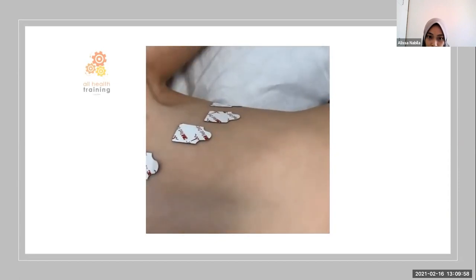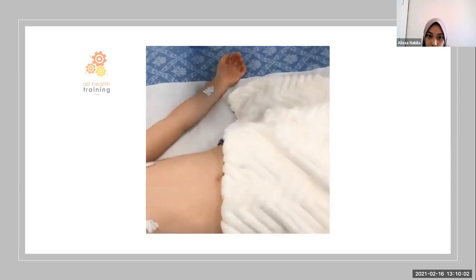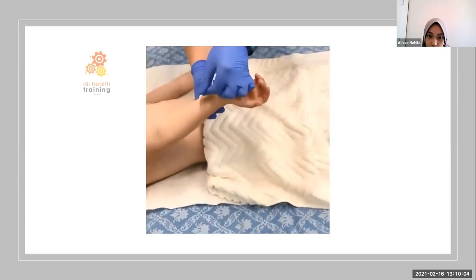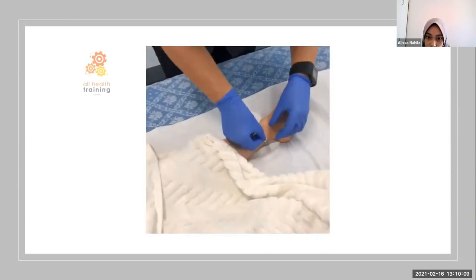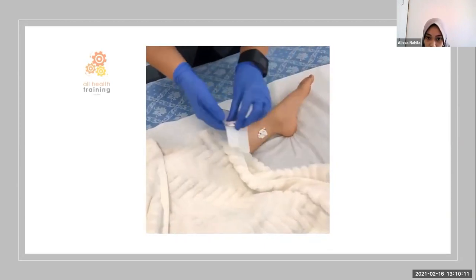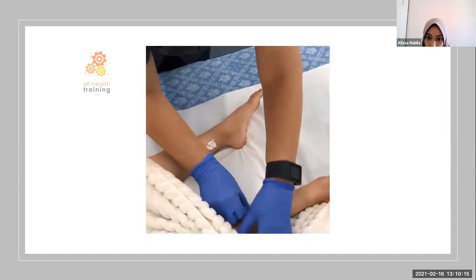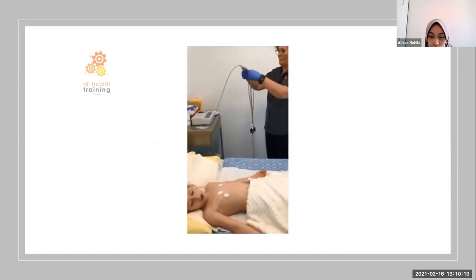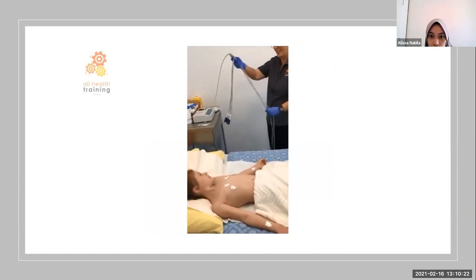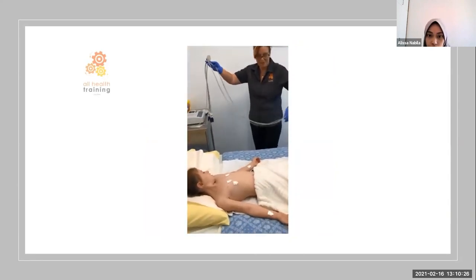And electrodes on the wrist will then be placed facing down. And one on the other one. Good job. And ankles facing up. It's a bit chilly in this room. The stickers are cold. That's all right. Look at you. You're going to be like a movie star now.